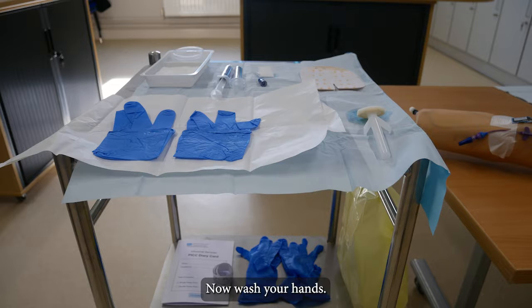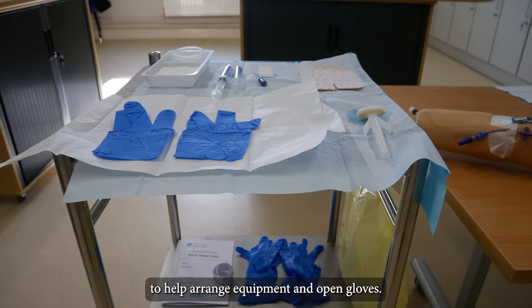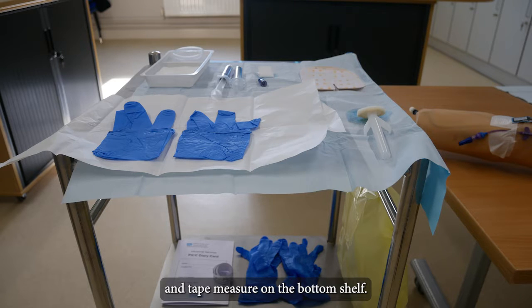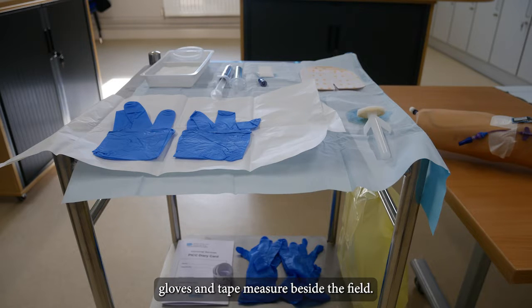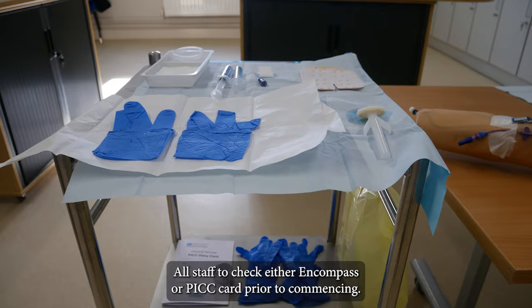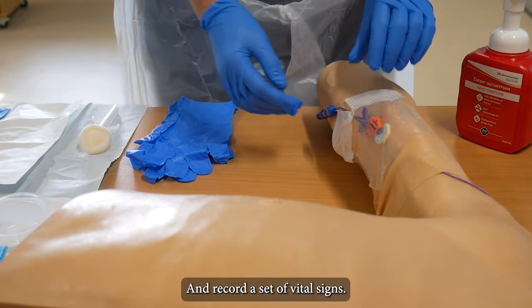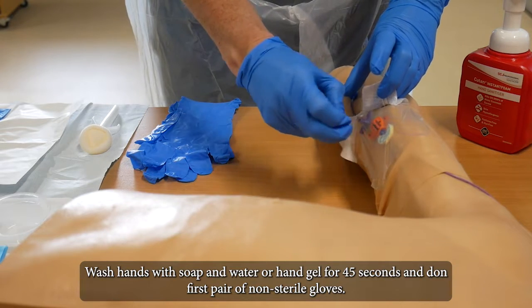If in the community, place onto a clean surface. Now wash your hands, open blue field using both hands, then put all equipment onto blue field adhering to ANTT. You can use your yellow bag to help arrange equipment and open gloves. If using dressing trolley, leave two pairs of non-sterile gloves and tape measure on the bottom shelf. Community staff leave two pairs of non-sterile gloves and tape measure beside the field. All staff to check either in Encompass or PICC card prior to commencing and record a set of vital signs. Wash hands with soap and water or hand gel for 45 seconds and don first pair of non-sterile gloves.